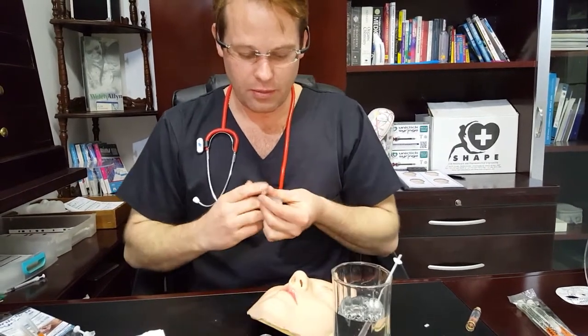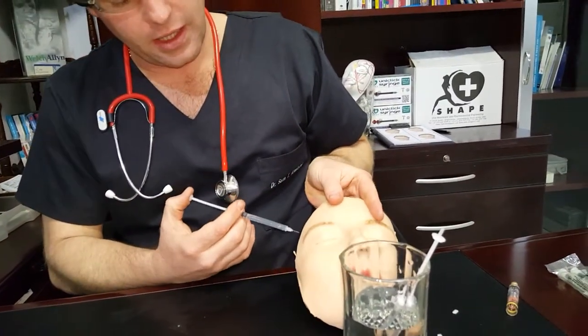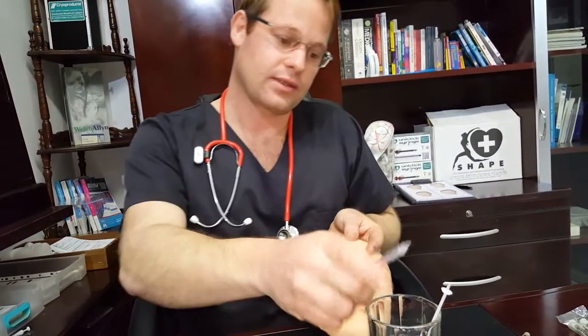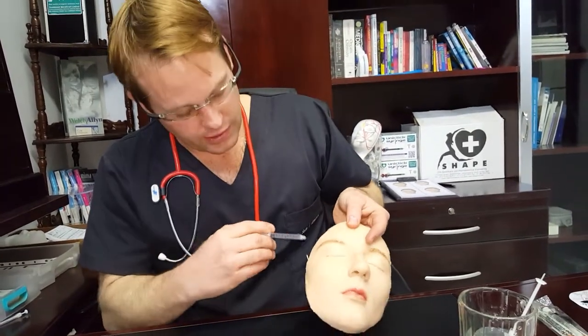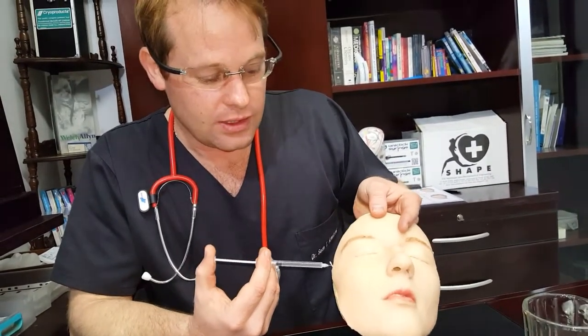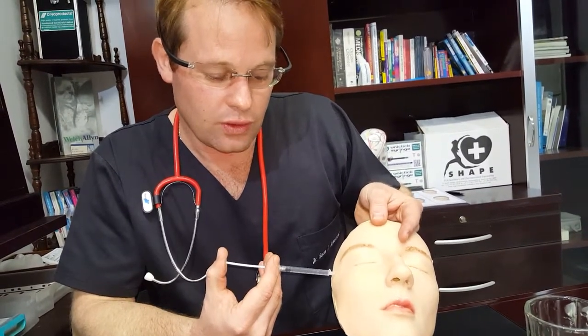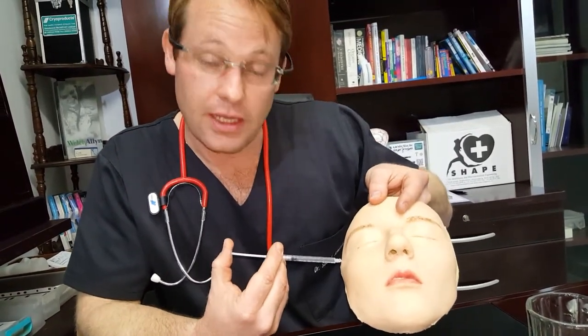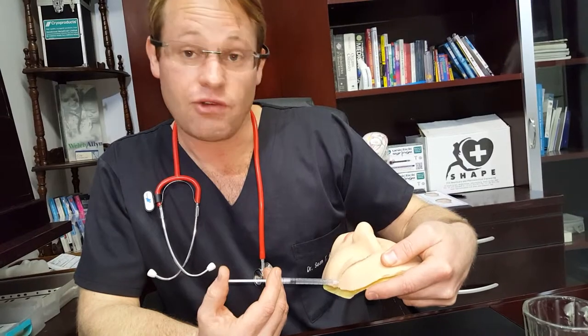When administering to a patient — this is our lovely little patient — we take care in dose regulation, and using the UniClick makes it a little bit easier to dose regulate. Because you don't have to look at those little lines for every dose you're injecting, you can hear it and feel it. It makes a lot more sense to use dose regulation that is audible and tactile, especially when dealing with highly potent products that are expensive or harmful at unregulated dosages.